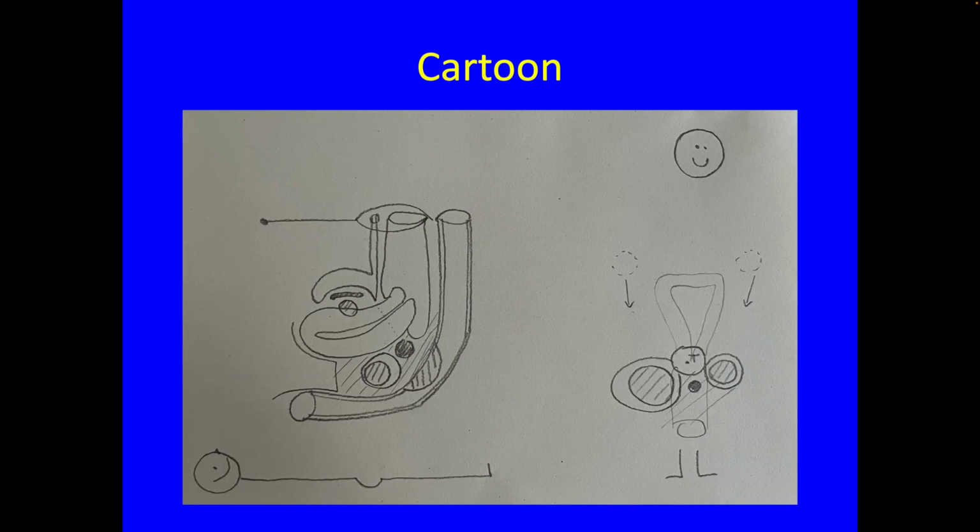And at the end of the scan, I like to draw patients a cartoon. People find it easy to understand what I'm trying to explain to them. So here would be that nodule of superficial adenomyosis, the deep endometriosis associated with it within fibrosis. At the level of the torus, we had the nodule of deep endometriosis plaque. There's the ovarian endometrioma adherent just close to it. This is that bowel nodule that spans across the level of the torus, so it's lower and upper rectum, and then these dense adhesions, so the peritoneum is only to there.